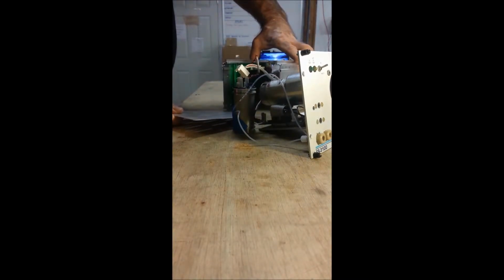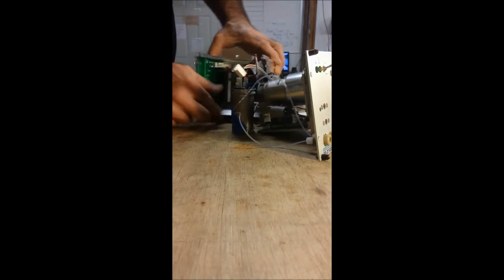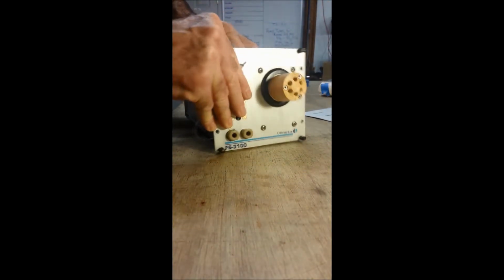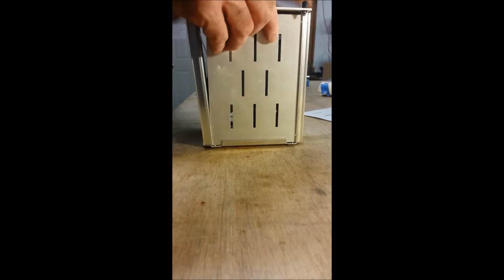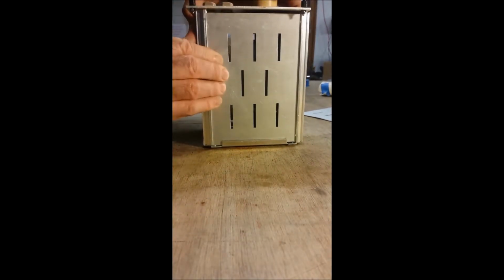So once you're ready to do this, feed the plate in, feed the heater in now that the connection's all in there. And then you want to come to the top, and you need to secure. Once you get one screw in, it just gets easier after that.